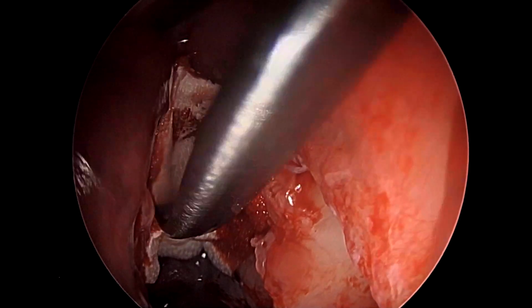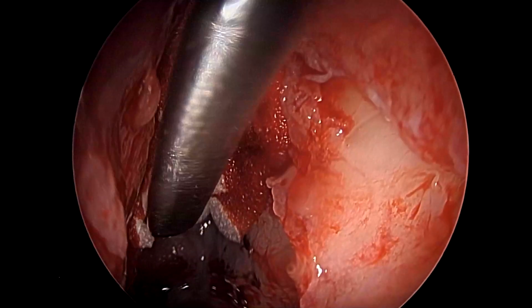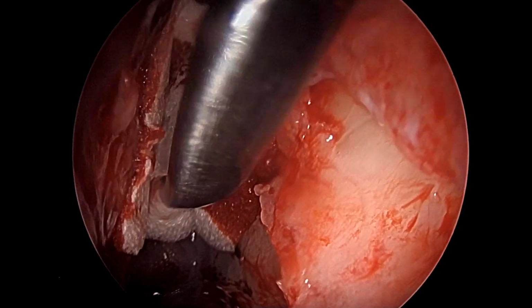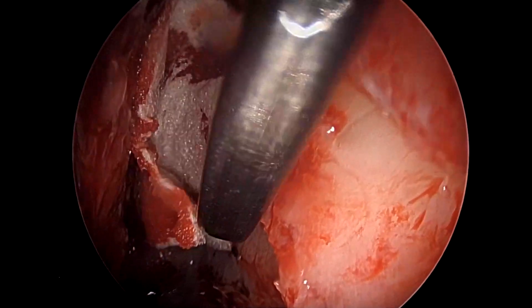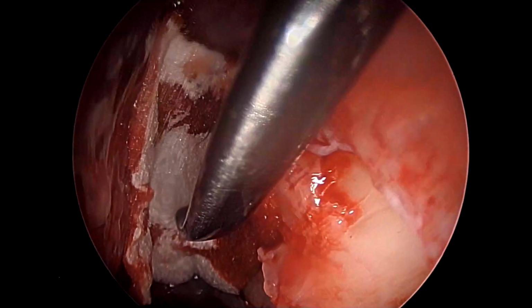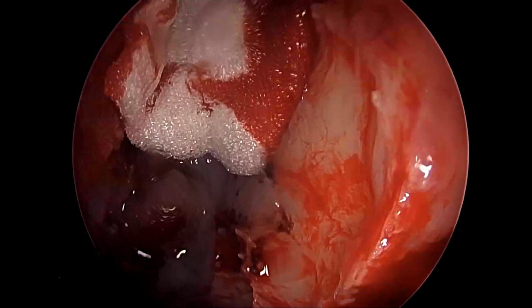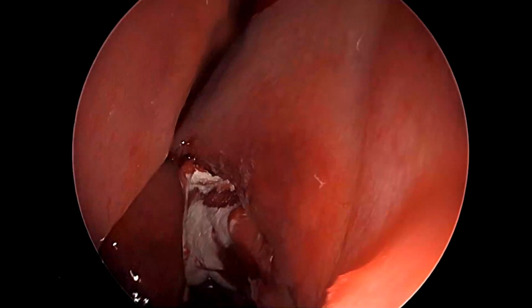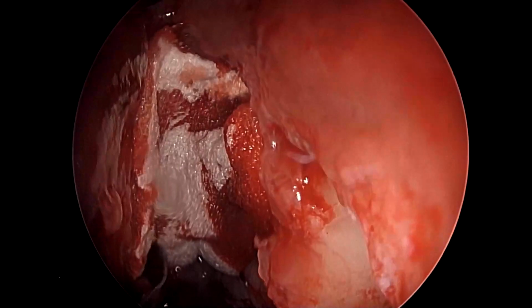So as you see here, we have the gel foam, and its size has been tailored, and reasonably well covered in a single sheet from the middle turbinate to the lamina papyracea, right from the frontal recess to the posterior ethmoids, thus not letting any portion of the reconstruction be exposed to the surroundings or to the back.